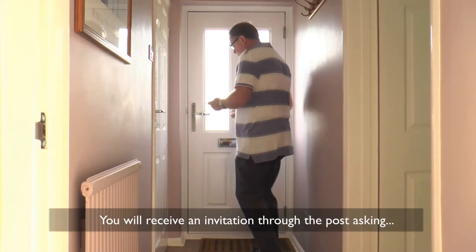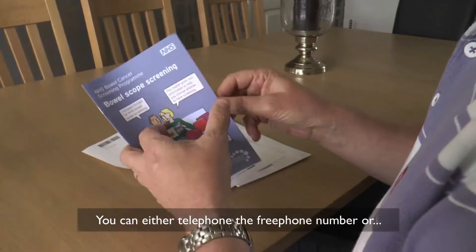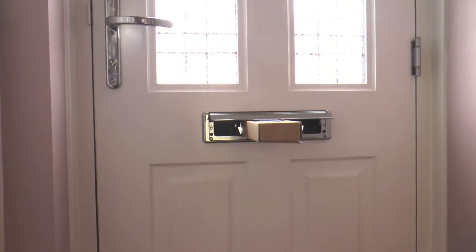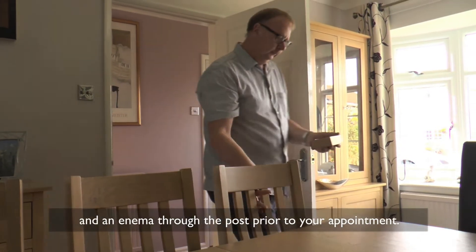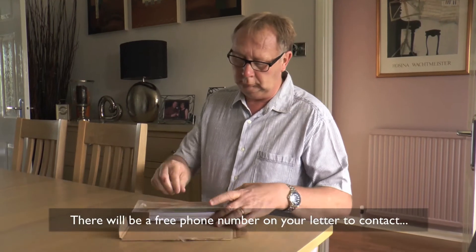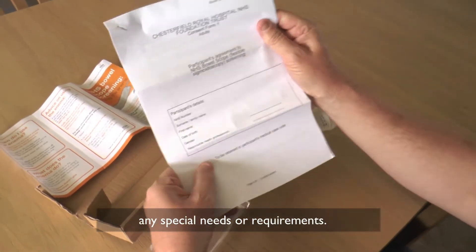You will receive an invitation through the post asking if you wish to take part in Bowel Scope screening. You can either telephone the free phone number or use the prepaid envelope to confirm. Then you will receive a confirmation of your appointment and an enema through the post prior to your appointment. There will be a free phone number on your letter to contact if your appointment is unsuitable or if you have any special needs or requirements.